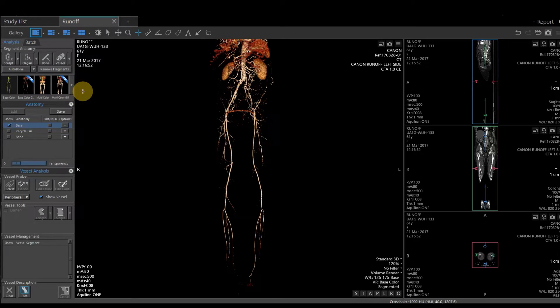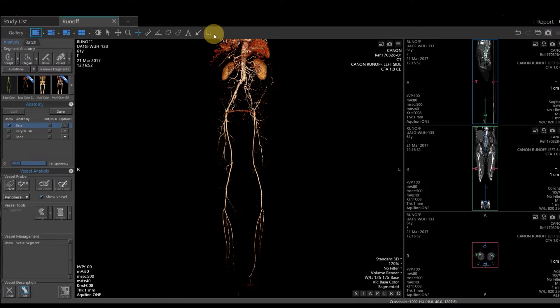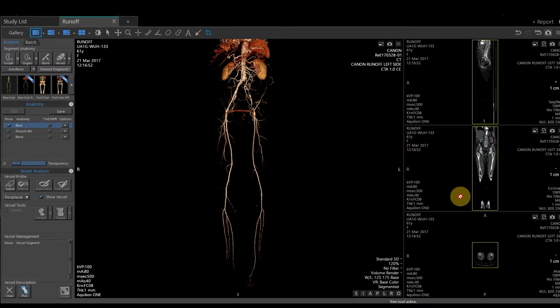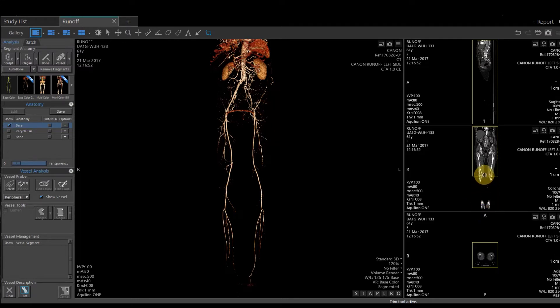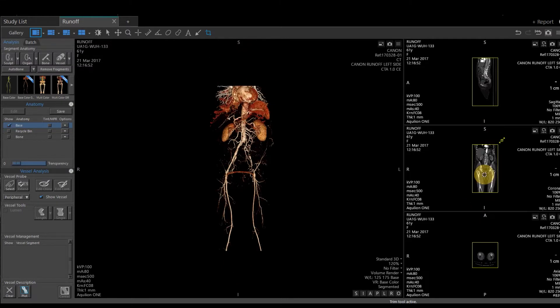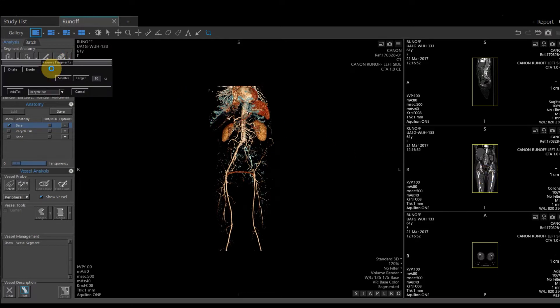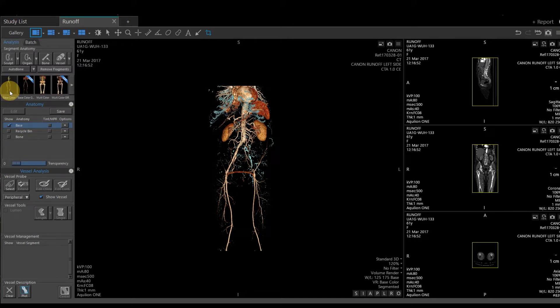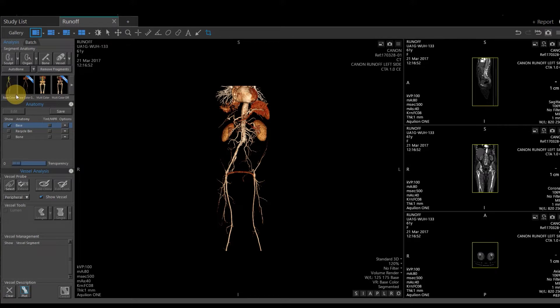A little trick to keep that from happening: on the toolbar you have a trim icon. If you select the trim tool, I like to come over to my coronal image, grab the bottom yellow line, drag that above the knees. I'm then going to hit Remove Fragments. Let's say I'm okay with that. I'm going to add that to the recycle bin. Remove Fragments will not cut anything off that it cannot see. So everything below the knees will remain intact.